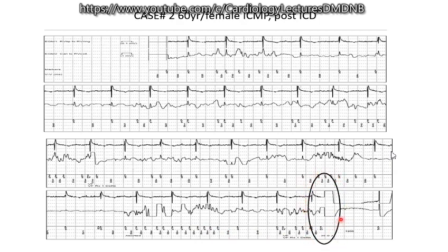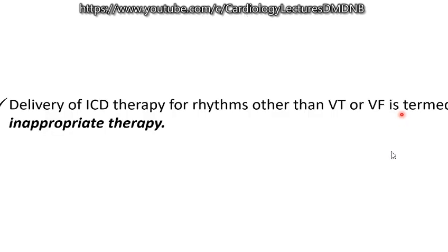This is an inappropriate shock. So for any patient who gets therapy, you should always go through the device EGMs before giving therapy to the patient. We should know whether the shock is appropriate or inappropriate. So what do we mean by an inappropriate shock? Any therapy given by the ICD, any shock given by the ICD which is not for VT or VF, is an inappropriate therapy.